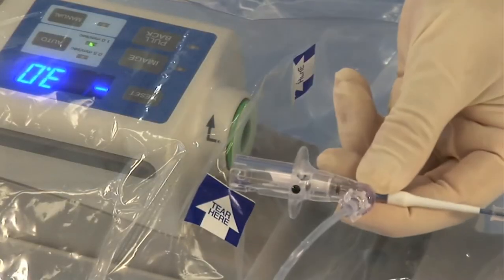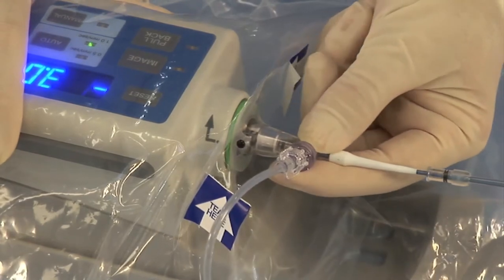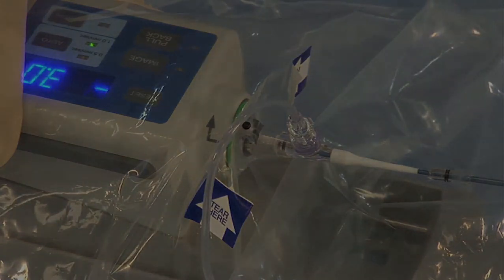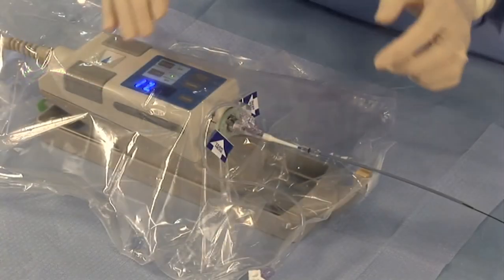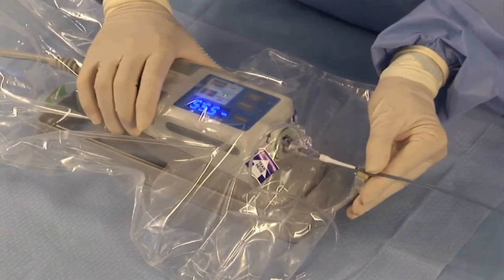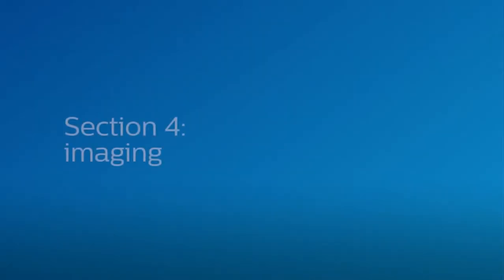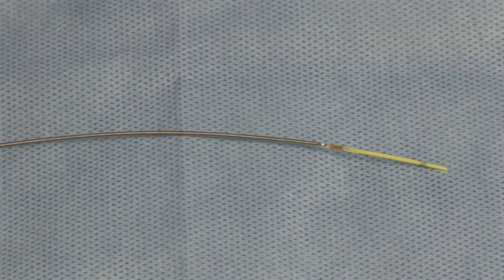Insert the prepped catheter into the device by aligning the black dots on the catheter and device. Then turn to lock the catheter into place. Note: take care to avoid opening the telescope section of the catheter at this step, as this could introduce air in the system and require reflushing the catheter prior to use. Ensure the sled is advanced completely forward. Then secure the catheter onto the sled arm using the hub on the proximal telescope shaft. Ensure the imaging core is at its full distal position. Examine the imaging core within the clear distal shaft to ensure no air is in the system.